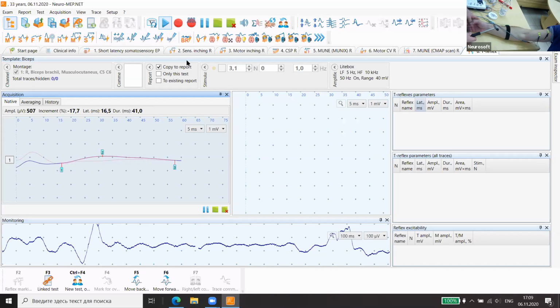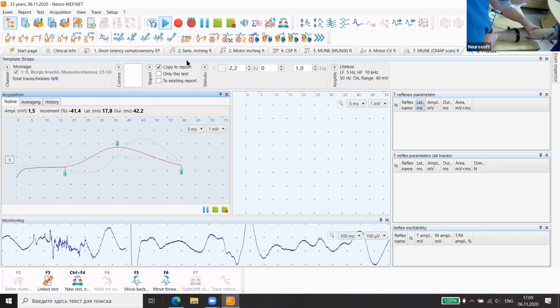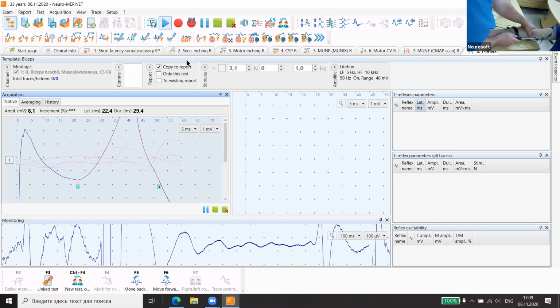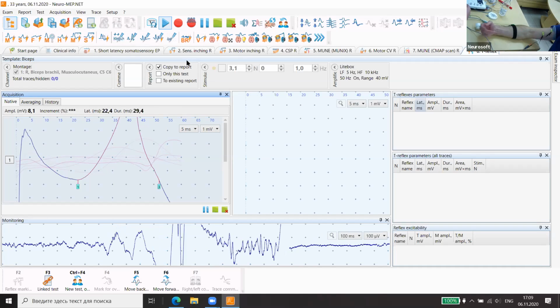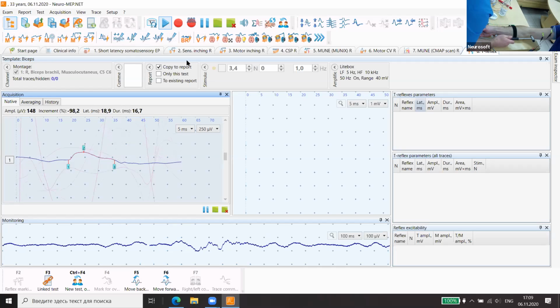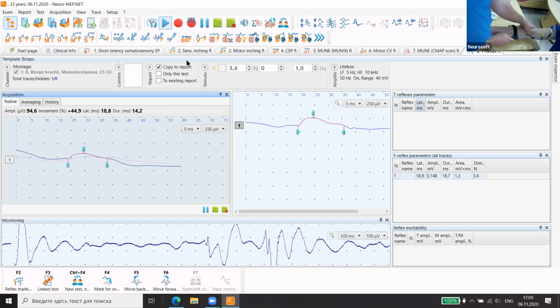We need to relax the patient. Wait a little. Relax. Oh, at last we can see a small answer. They're not very high. Yes, okay.